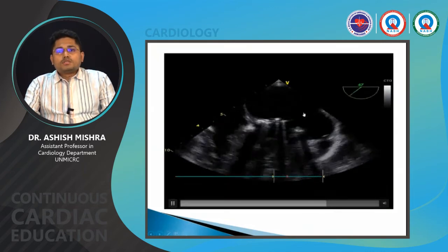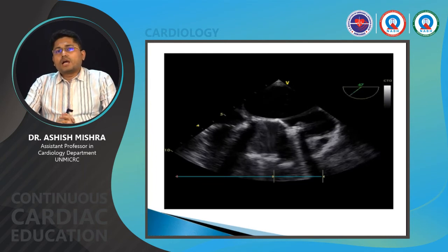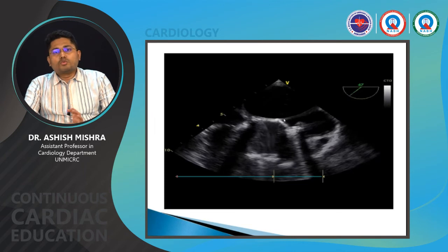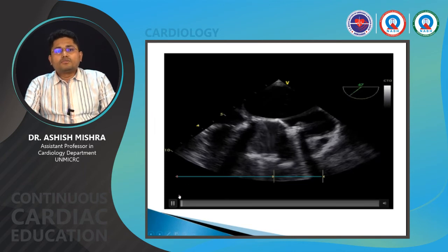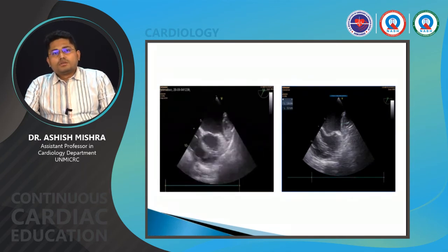After a detailed heart team discussion and discussion with the relatives, the patient was thrombolyzed. The patient was intubated and thrombolyzed. After correcting for the INR, which on presentation was about 2.1, we achieved good leaflet movement, and the gradient reduced to a mean gradient of about 6 millimeters of mercury.